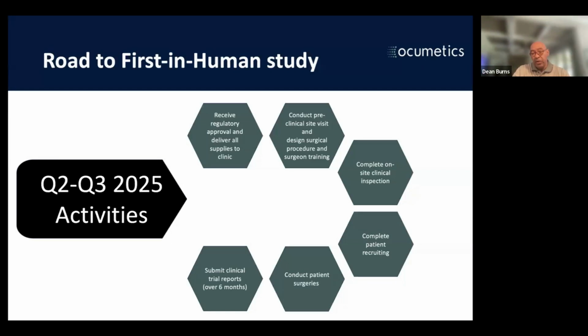One of the big reasons driving that is we want to be in a position to put this lens in both eyes, so that we can understand what binocular summation is going to look like with this technology ahead of going into a multi-clinical trial with the FDA sometime next year.